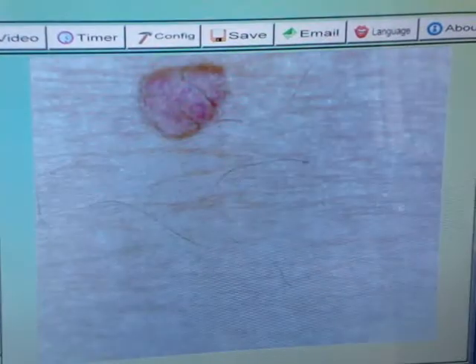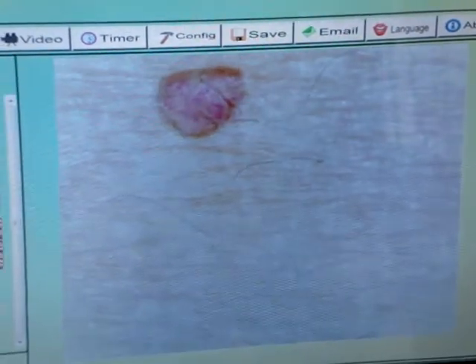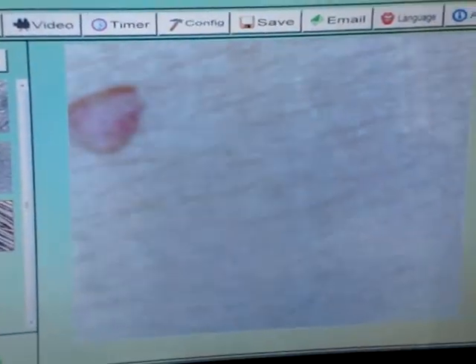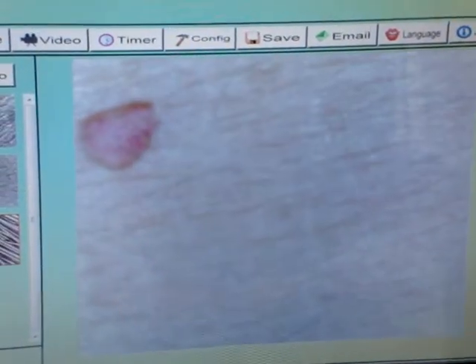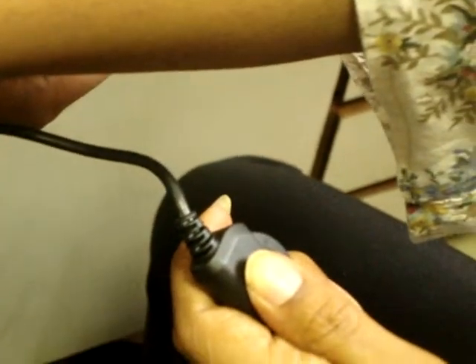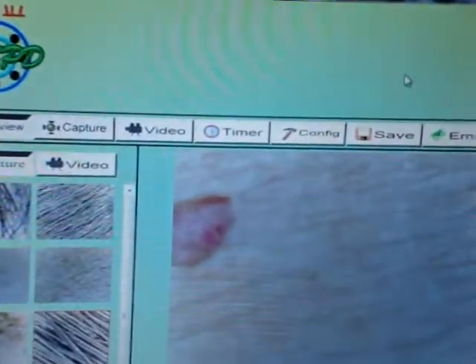Once you have acquired the image you want, you now capture by clicking the capture button, or else you can press the capture icon on the screen to do the same.